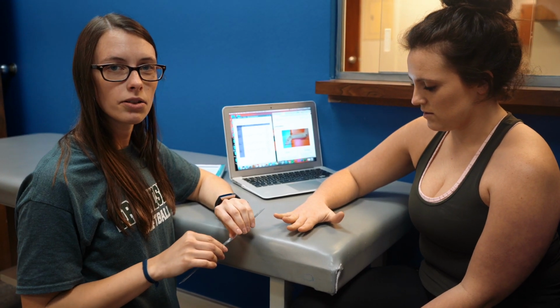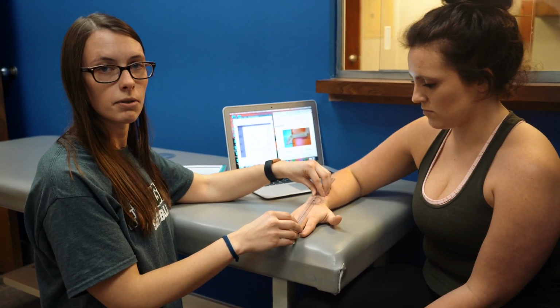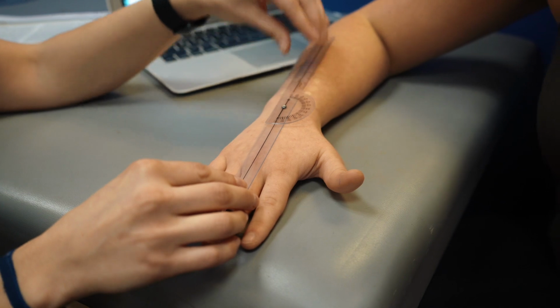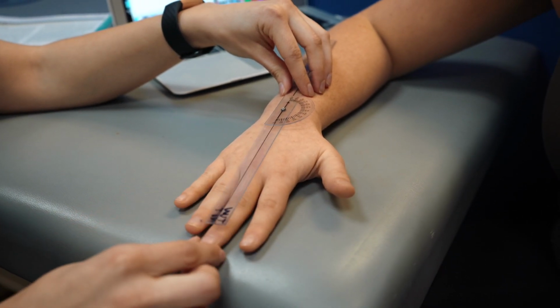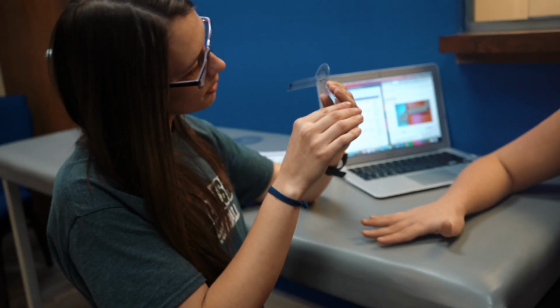Alright, so we're doing wrist ulnar deviation, and when you're measuring this, you want to make sure that the half sun is pointing in the opposite direction of where the wrist is moving. So we're going to align the center of the fulcrum to the dorsal part of the wrist, and we're going to align the stationary arm on her forearm and the moving arm on her middle finger. So go ahead and deviate ulnarly for me. Alright. So she scored a 35, which is within average.